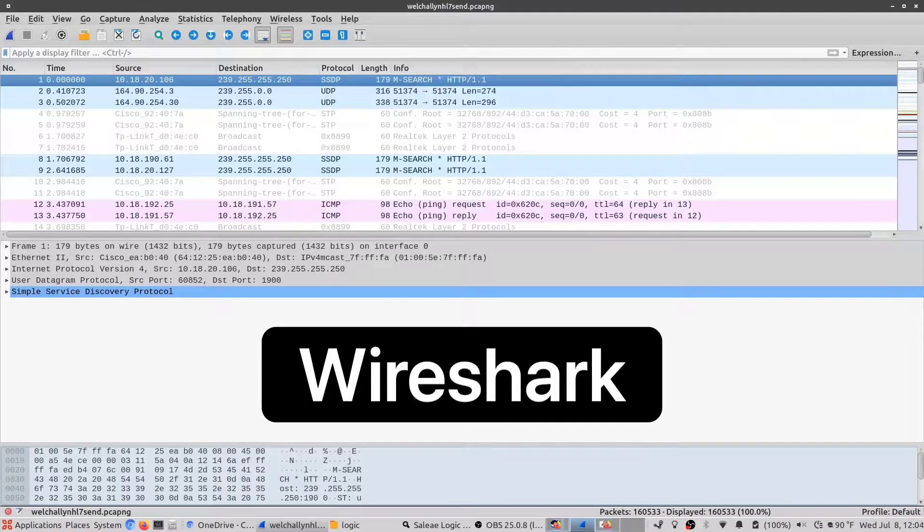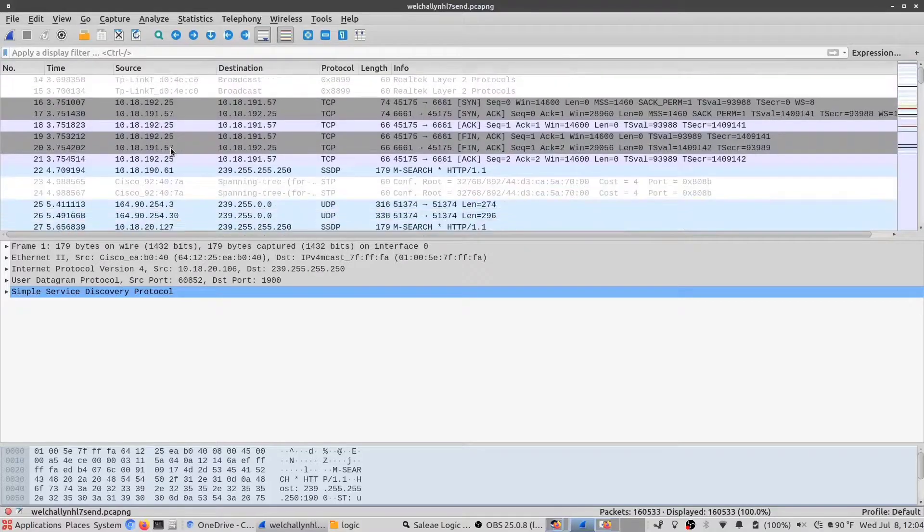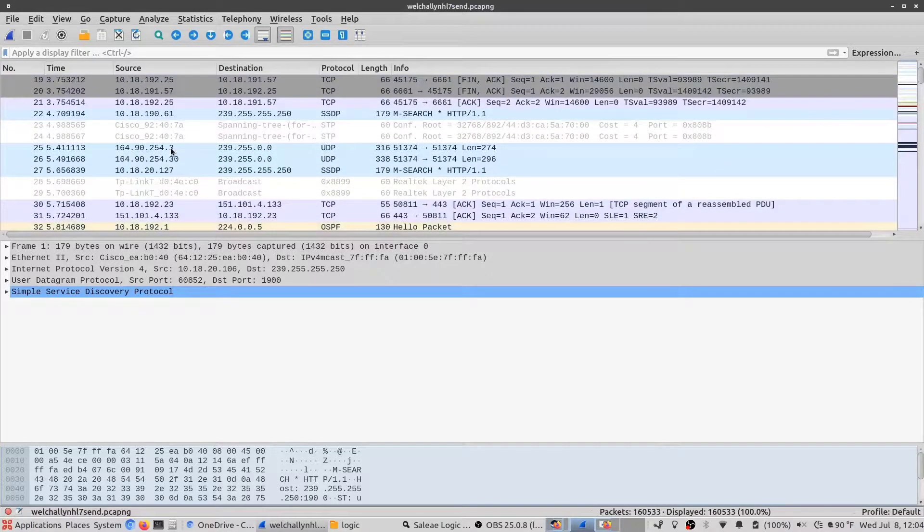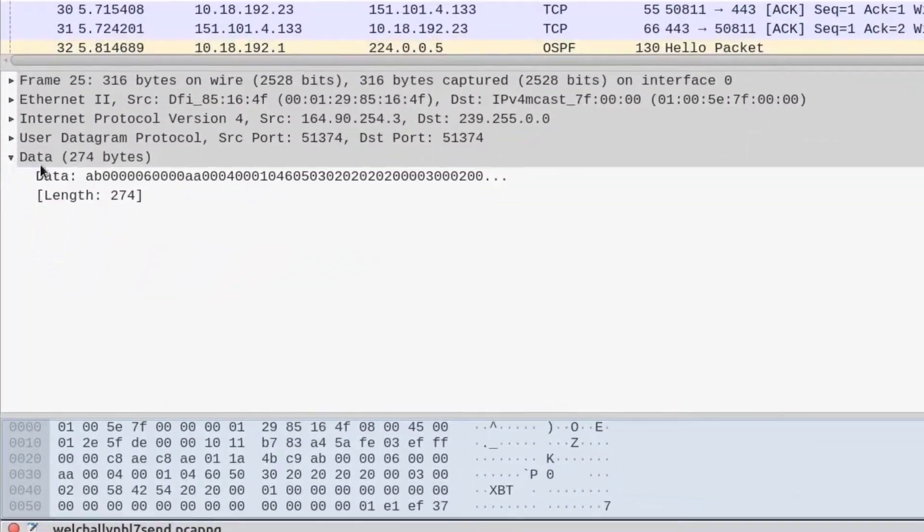Now we're going to be using a program called Wireshark, which you may have heard of before. This is a program that lets you do packet captures on a network, so you're able to see packets as they go across a link.